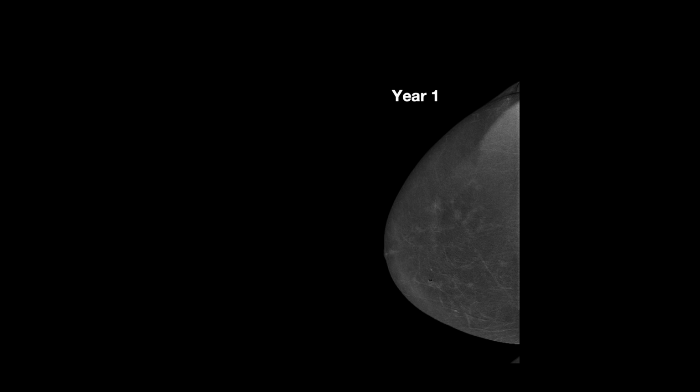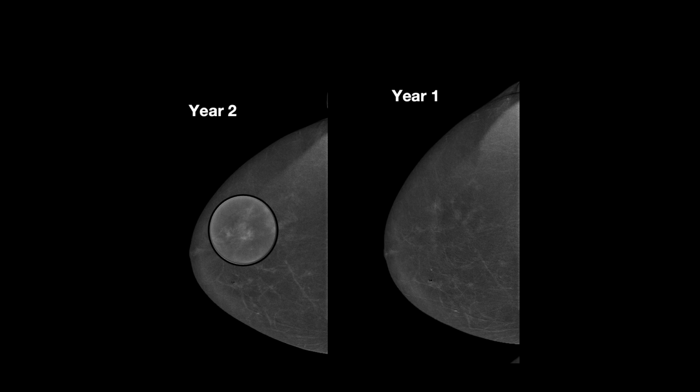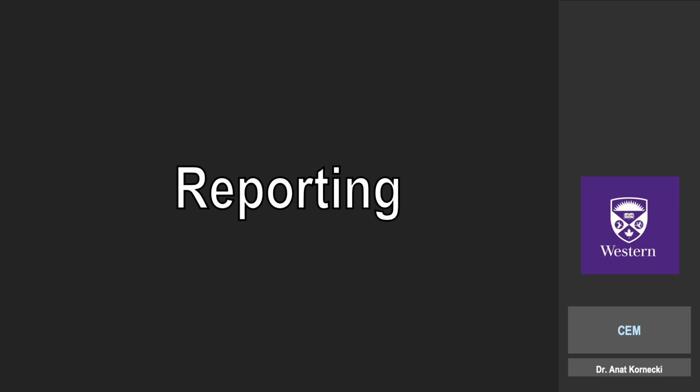The patient will have the study at the first year, like in this case, baseline, and then the second year, showing that there is, in this case, developing breast cancer. This is, by the way, not from CIMIST, but this is a screening contrast-enhanced mammography example, showing you the possibilities that we have with screening and contrast-enhanced mammography.